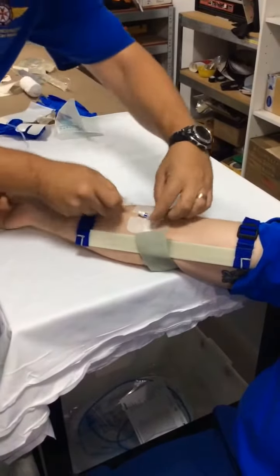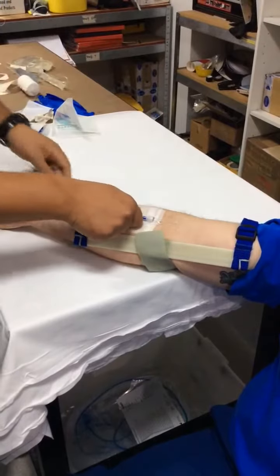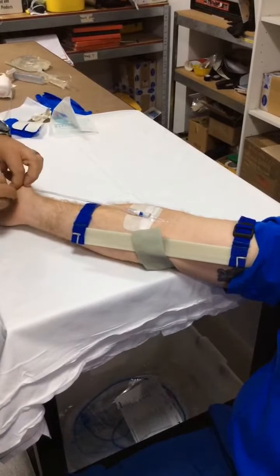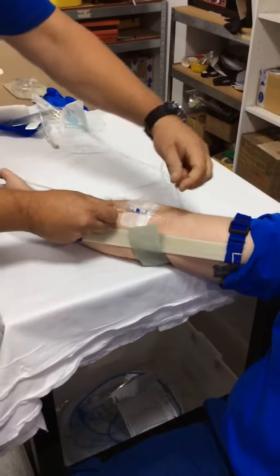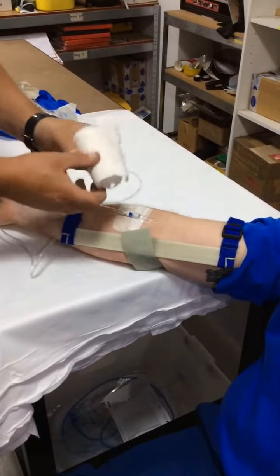Fluid is connected. Not using gloves for this exercise. It's important that this doesn't become dislodged later in the job. At this point, a roll of bandage is brought into it.